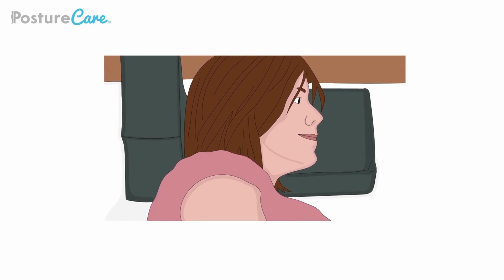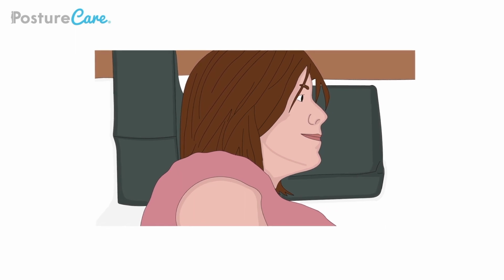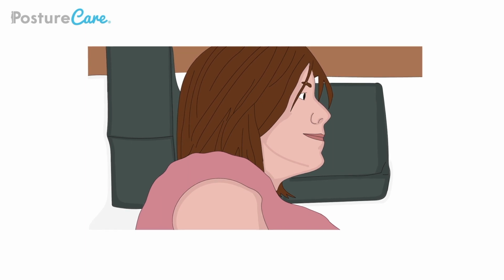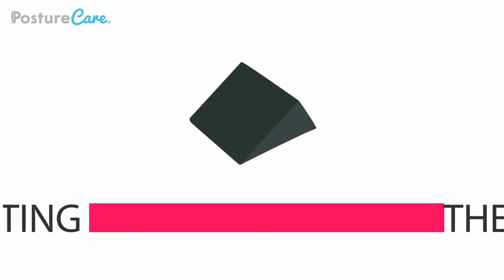Again, we are trying to support the head and neck only, allowing the shoulder to be in direct contact with the bed. The cushion is also designed to provide a point of reference for those clients that tend to pull their heads back in side lying. Supporting the back. Double edge wedge.